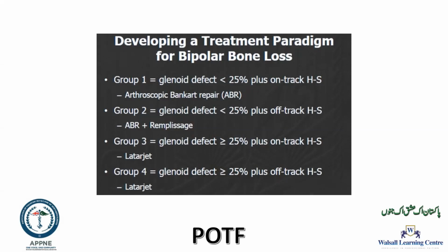You will always put your sutures for the Bankart first, and then do the remplissage, then tighten the remplissage, and then tie the Bankart. Otherwise, if you tie them in the front, it won't go back.